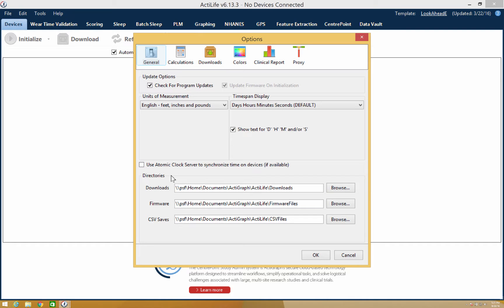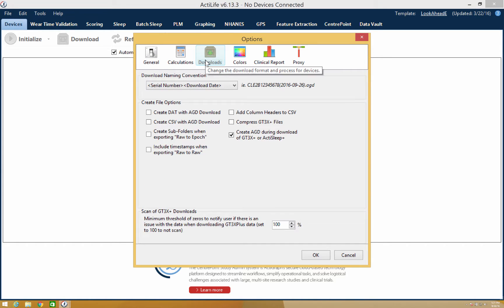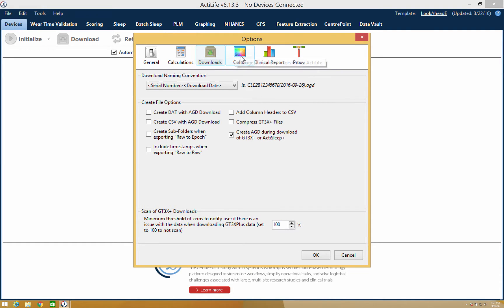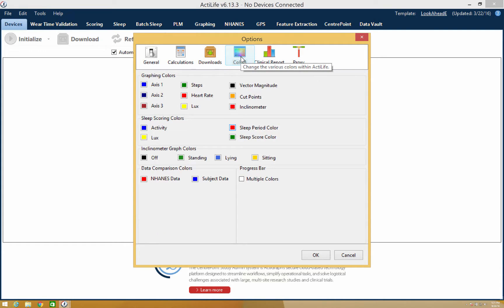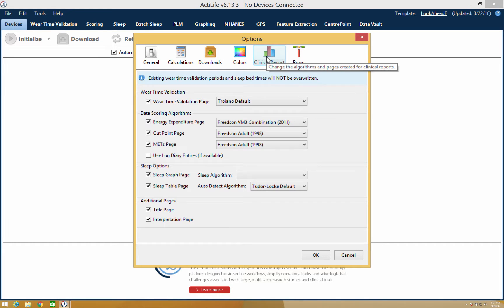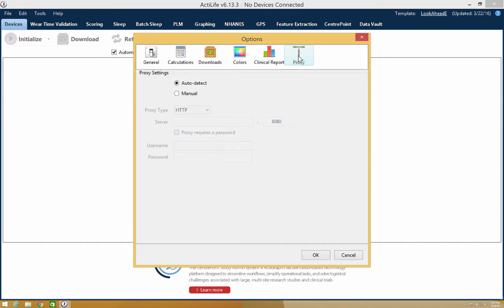Inside options, you'll also be able to customize your data downloads via the Downloading Naming Convention and create file options. You can customize your ActiLife colors, you can adjust your clinical report algorithms, or you can adjust your proxy settings.